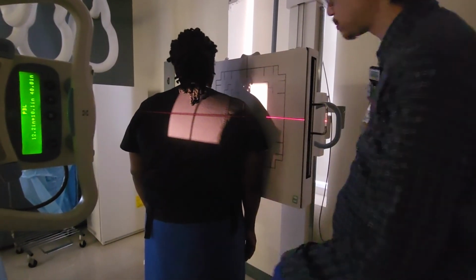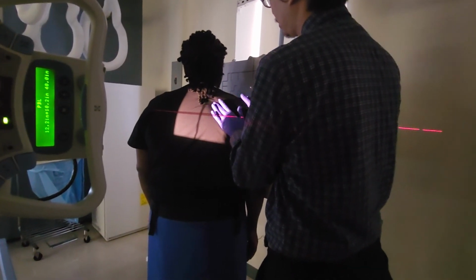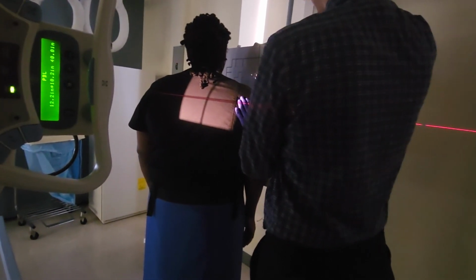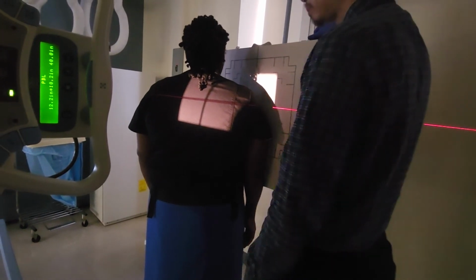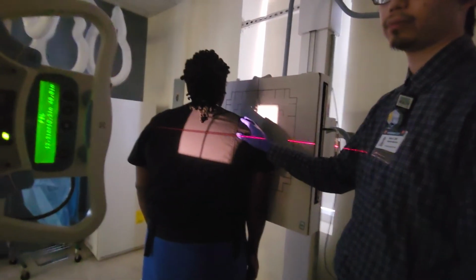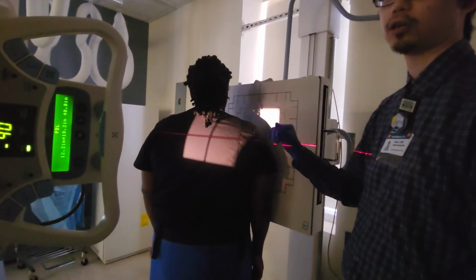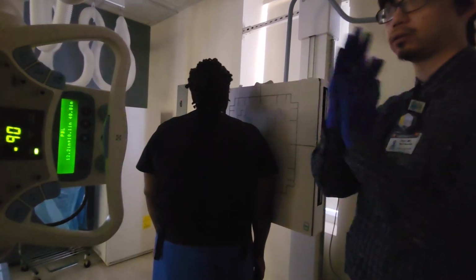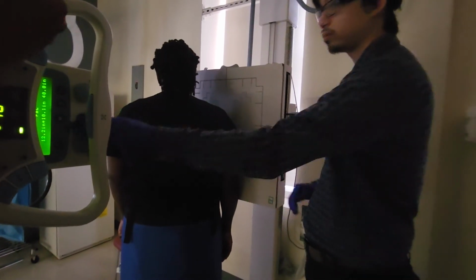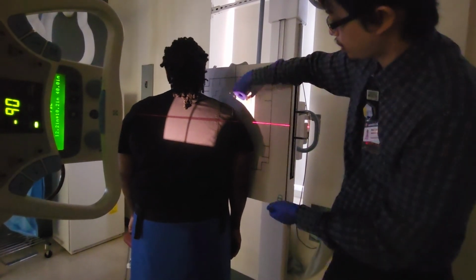Okay, so from here, just make sure our patient hasn't moved. The anatomy of interest in this position would be the scapula. So our area of interest is going to be the joint, the glenoid. We're going to be looking at the Y, but we're centered here on the glenoid, because that's where we're going to see our dislocation. Did it pop forwards or did it pop backwards? Which shoulder is this? Right shoulder. So I'm going to take my right marker, just plop it right here.